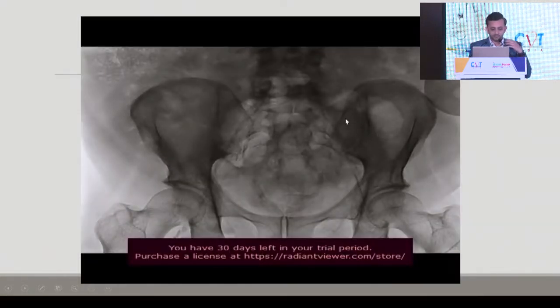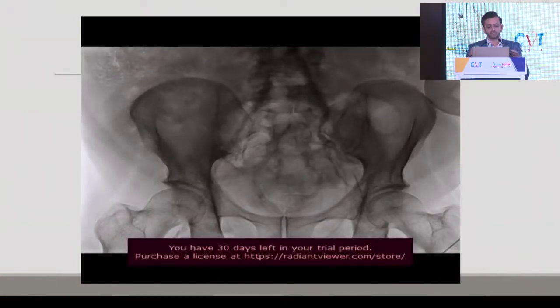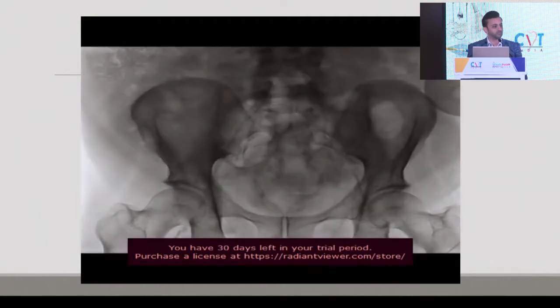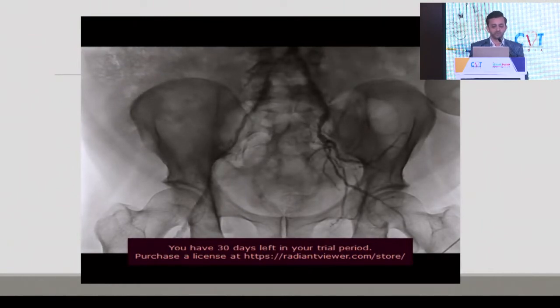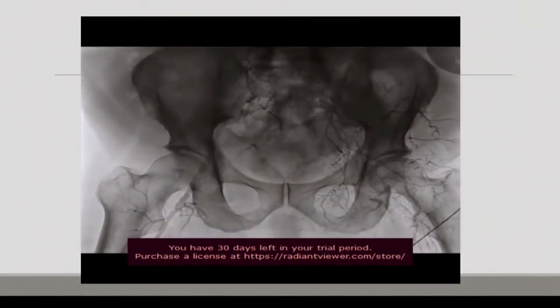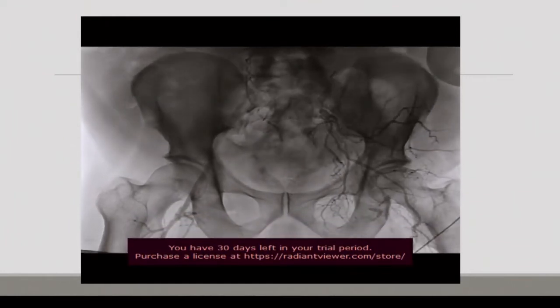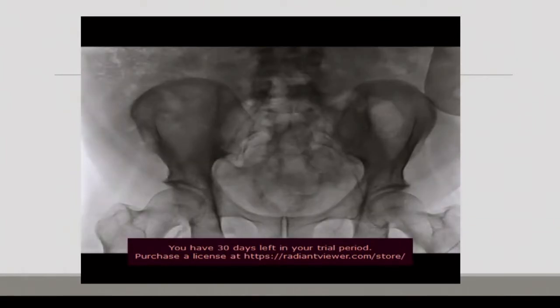So look at the femoral. We thought we'll take one pigtail from femoral. Look at both the femorals. We took this and we could not feel any femoral access. So we took this angio from a multipurpose catheter, which we pushed down from a left radial. And you can see fully calcified and completely occluded iliacs and femorals.